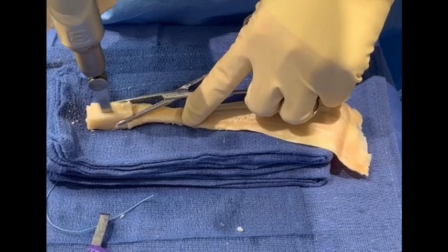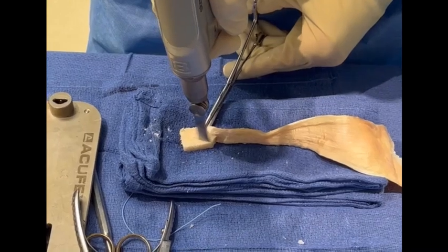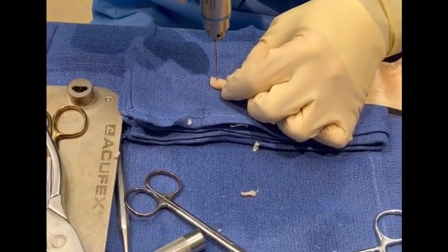On the back table, an Achilles tendon allograft is prepared with a 10 by 20 mm bone block for the tibial side. Additionally, 2 draw sutures are attached in the bone block, and the tendon side is prepared with a number 2 non-absorbable suture in whip stitch fashion.